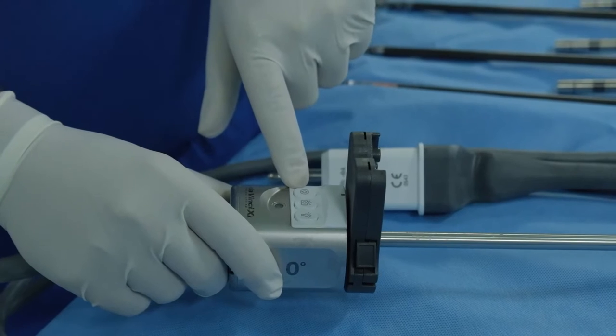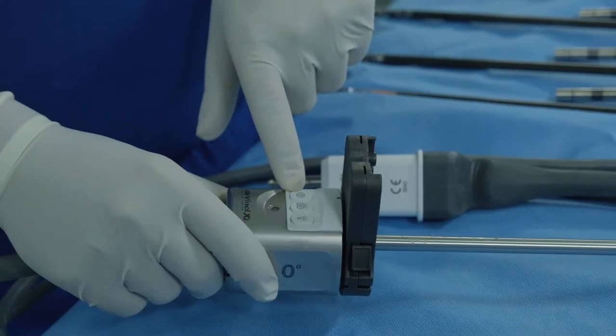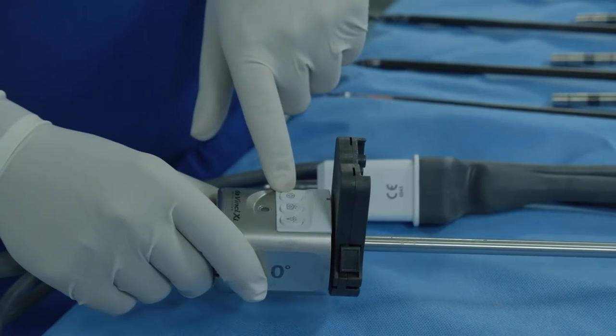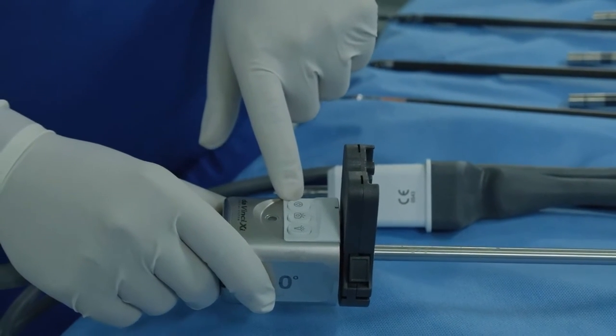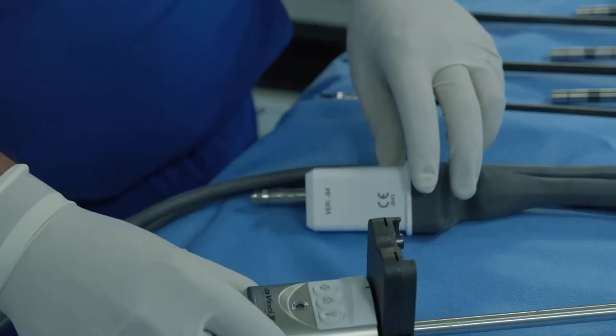This is the targeting button, which is used to target while docking. And this is what we are going to see when we dock our patient cart.